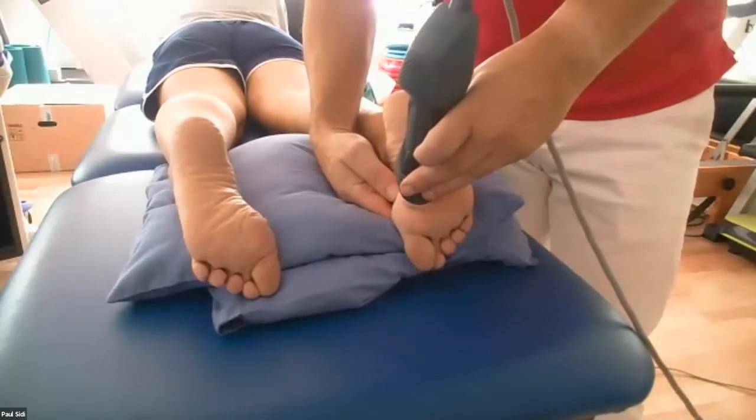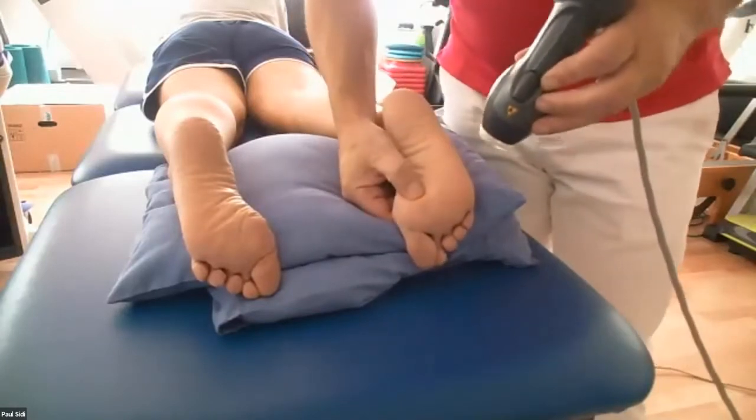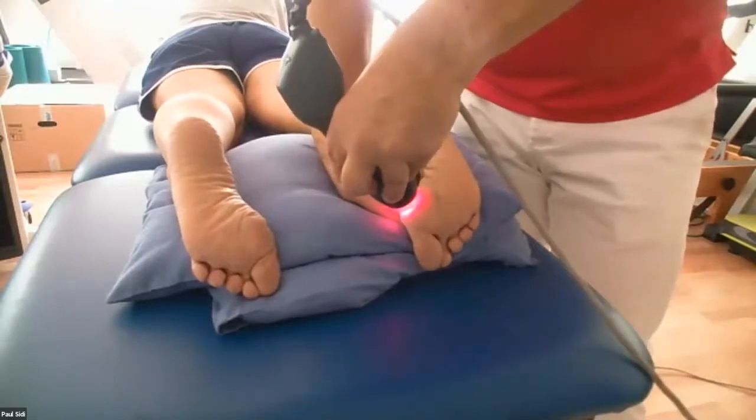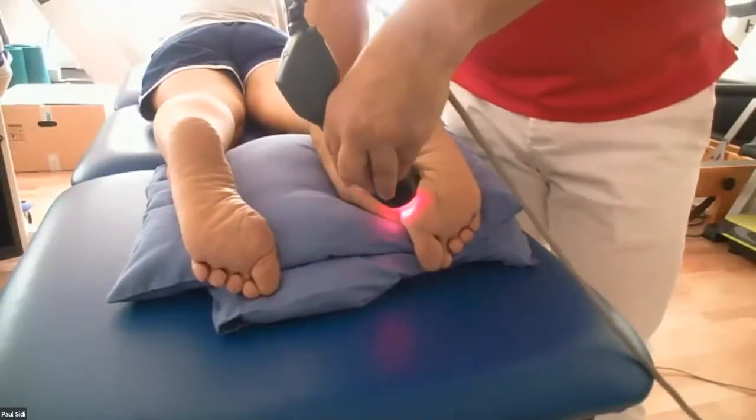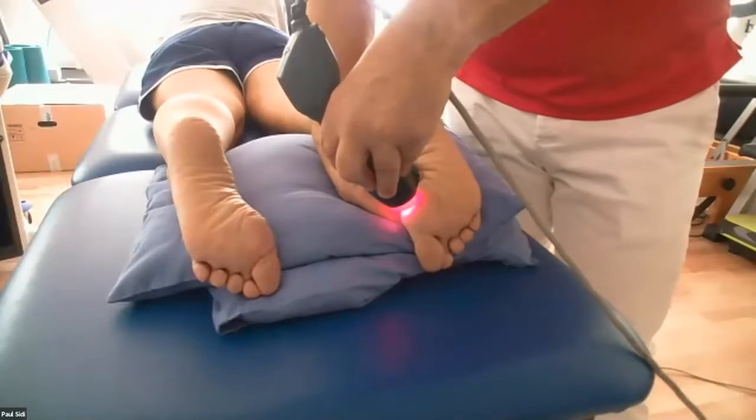It's a long time, 23 seconds. Stops, kept pressing in there. What's it like? Is it better? Much better. Much better, yeah. And probably do the other side, lateral and medial ones, okay? And so on, okay? So, use that as well.